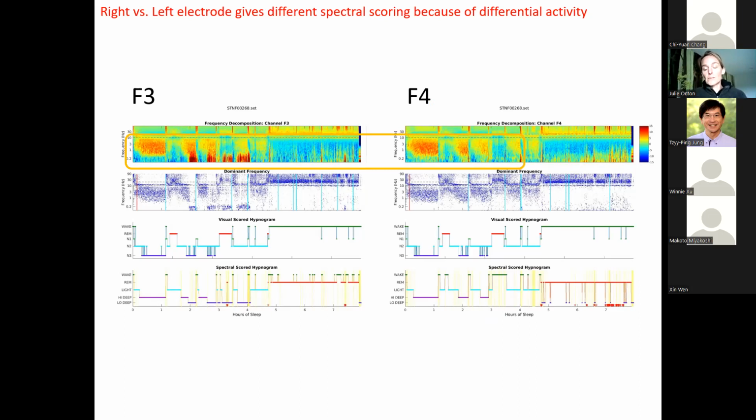But I don't know, it is what it is, but I think you can still get a lot of information out. But I do like to look at all three channels. It helps me. So I look at this and this and this, and if I was going to look as a clinician, then I could see exactly what's going on very clearly, no matter what the spectrogram or the hypnogram told me. And of course, you're not getting the back of the head, but I think it's probably fair that if they have slow oscillations, you're going to catch some of them at the front of the head.